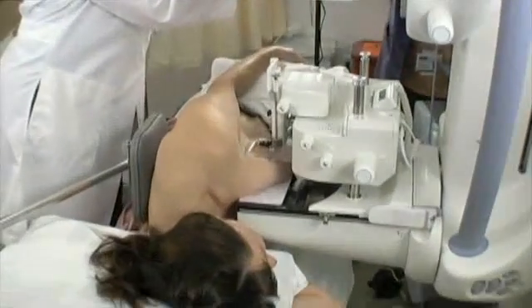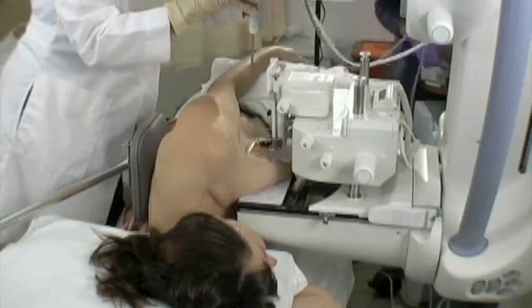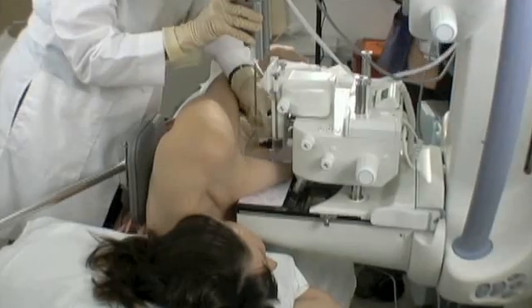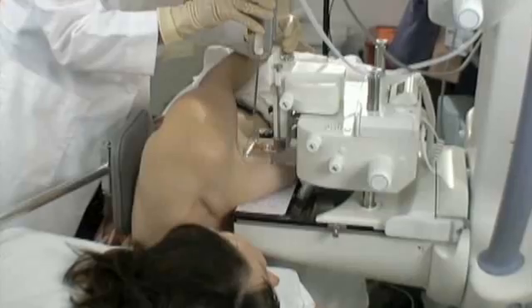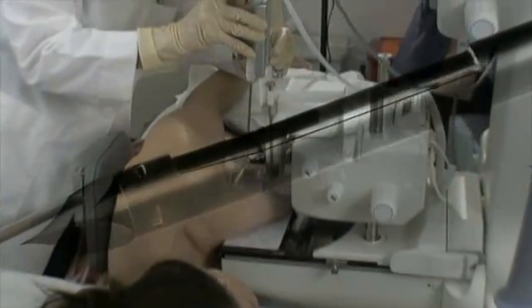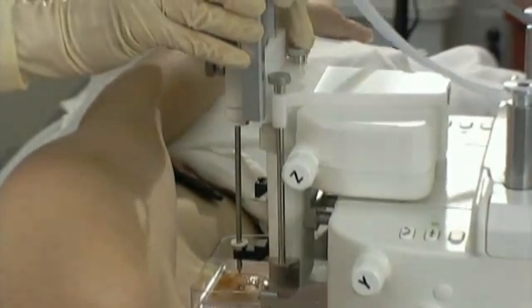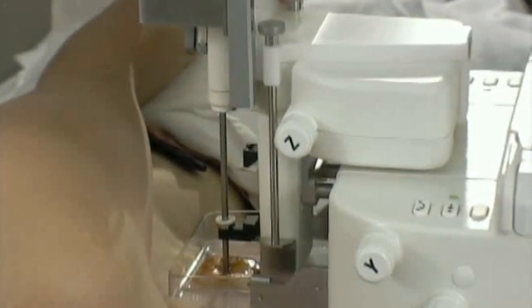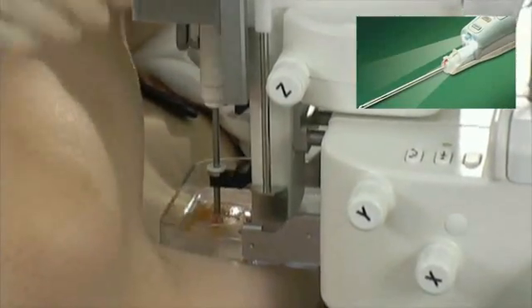I'll go ahead and take the Centerex needle — we take off the cover. I'm going to lift my needle guide up just a tad from the skin and guide this needle onto the holder and through the guide. Karen, you're going to feel me pushing on you here. I have it lined up beautifully — I'm going to push firmly. Excellent — needle's in place.